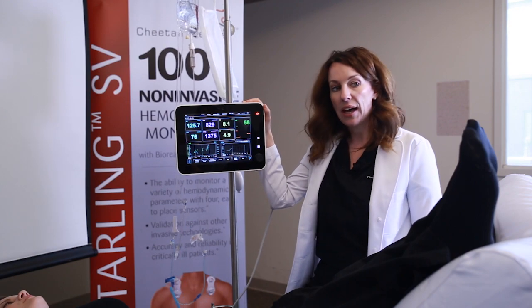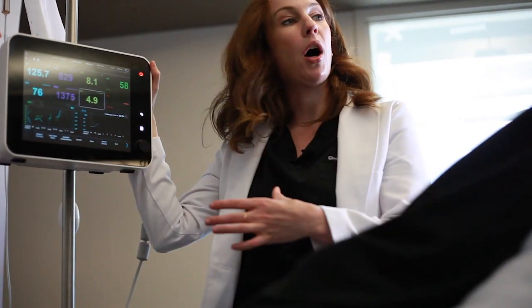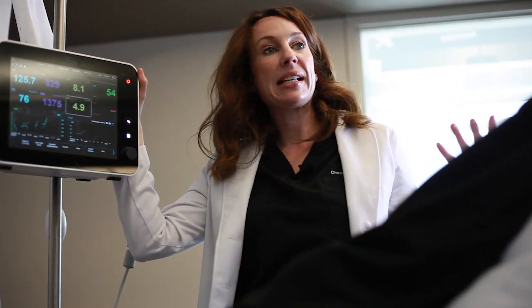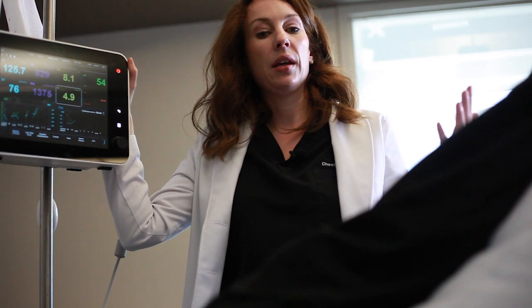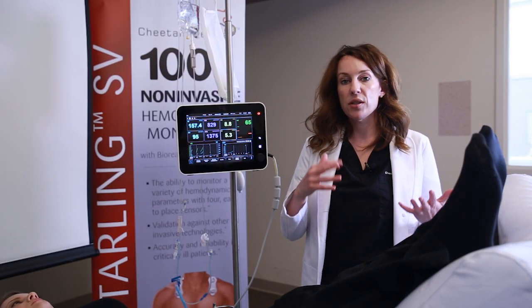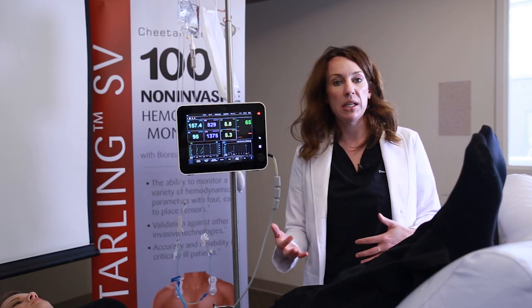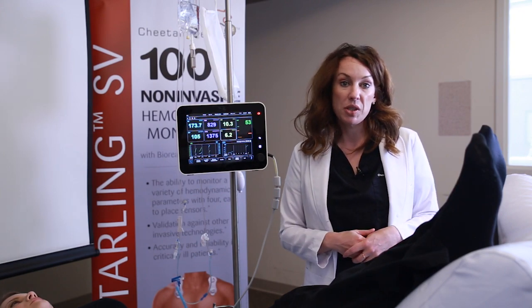And you'll notice that we have a timer that's counting down for us in our actual protocol box. So it says PLR challenge stage ends in 2 minutes and 51 seconds. So we will go ahead and wait for 3 minutes for the PLR to complete. So remember, what we're looking for here is a greater than or equal to 10% change in Annie's stroke volume index to be able to determine if she's considered volume responsive or not.